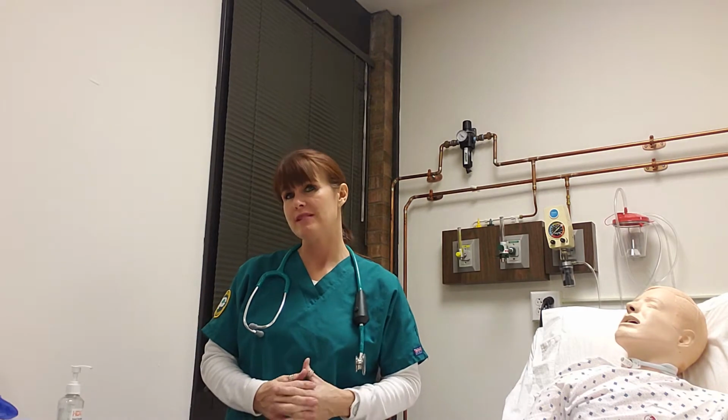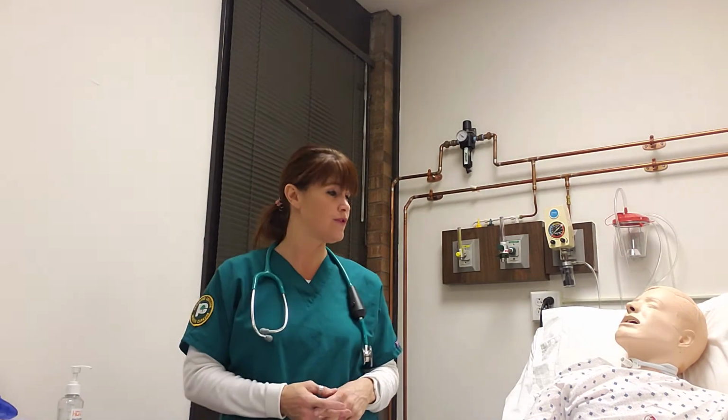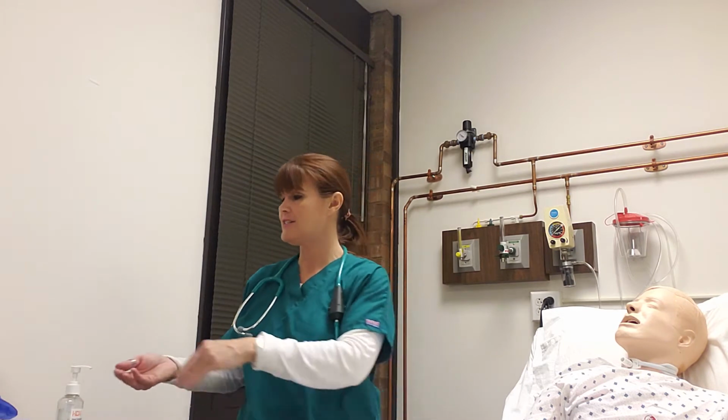Today I'd like to do a competency video for giving a patient a metered dose inhaler with Symbicort as the medication. The first thing you want to do is review the patient's chart and go over the doctor's orders. You always want to perform proper hand hygiene.